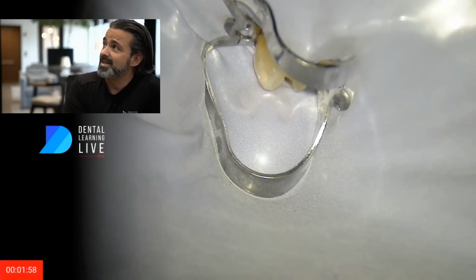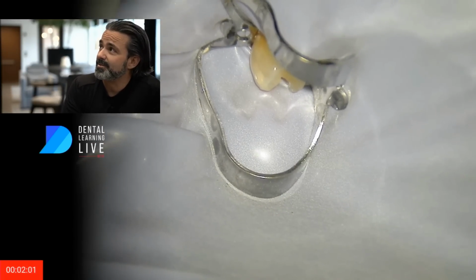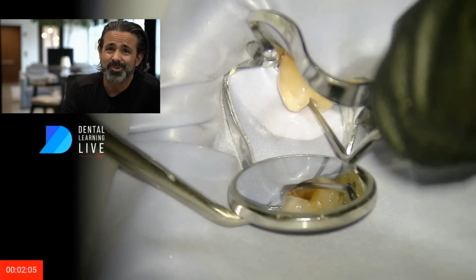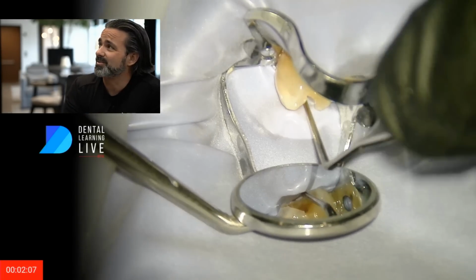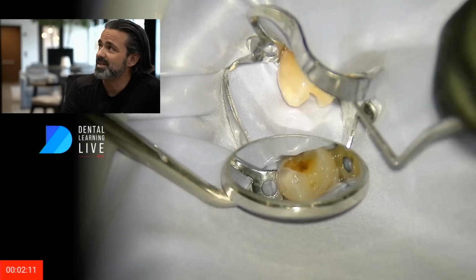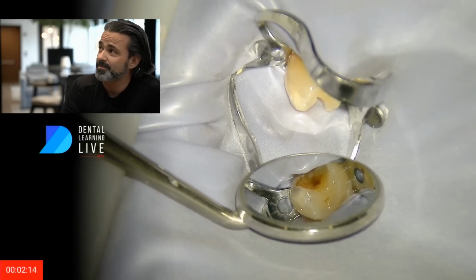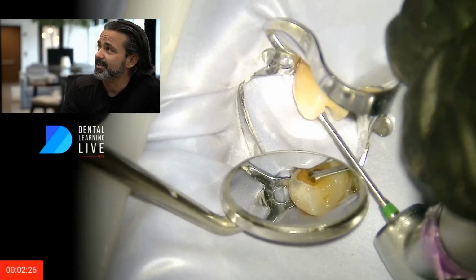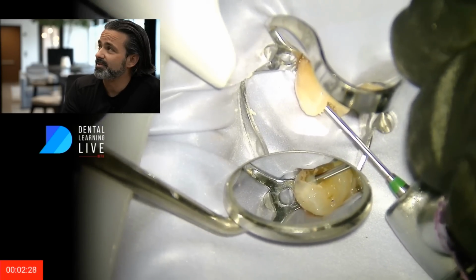So I'm isolating that, and I'm going to tuck that little piece of rubber dam that folds at that gingival margin right there. I'm just going to tuck it in. You can see that this is a carious exposure. You can see that it's full of decay, and there you go. We're going to just remove the decay.